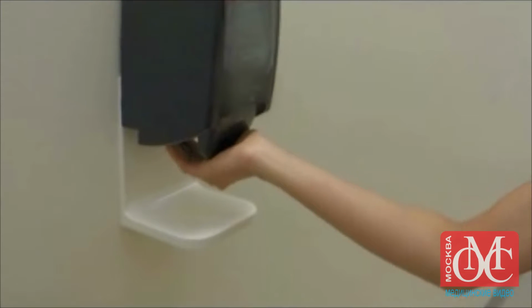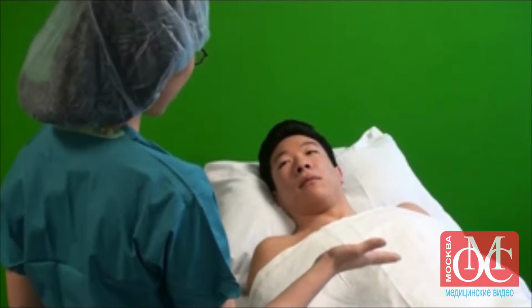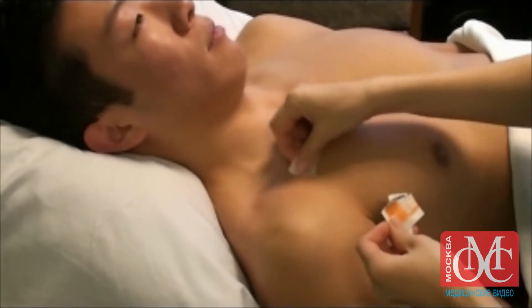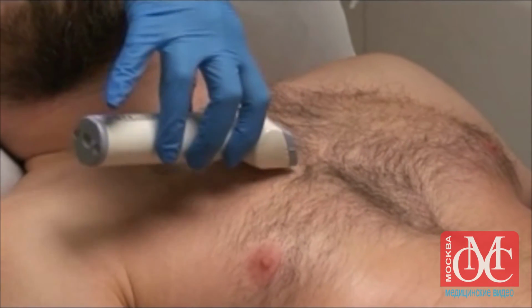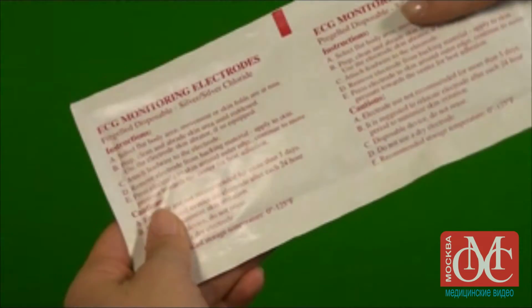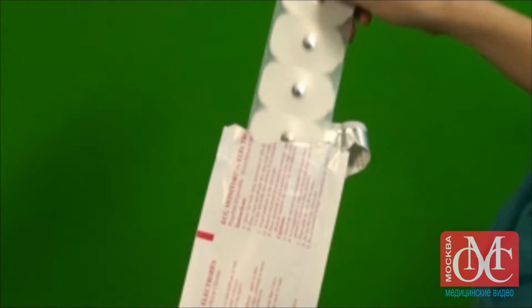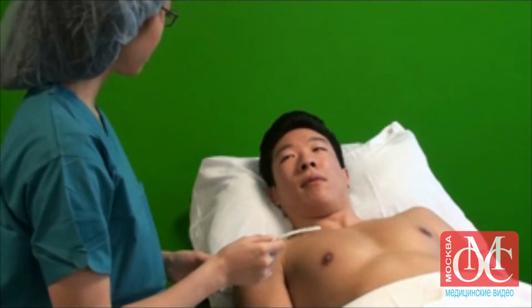Wash or sanitize your hands before entering the room and starting the procedure. If the patient is conscious, explain the procedure before proceeding. If needed, use an alcohol wipe to remove excess oil from the skin to improve the electrical conductivity. If the patient is hirsute, consider shaving the skin in the areas where the electrodes will be placed. Check the expiration date on the electrode packet. If the electrodes have not expired, open the packet and remove them.